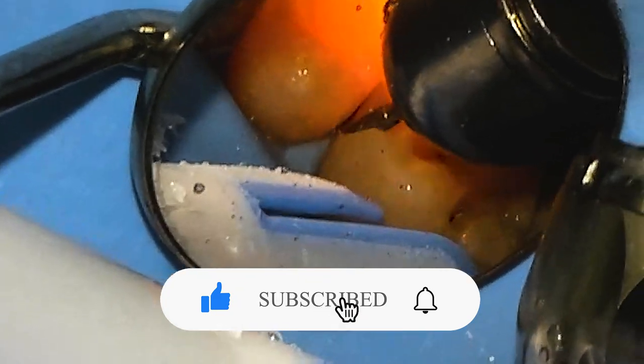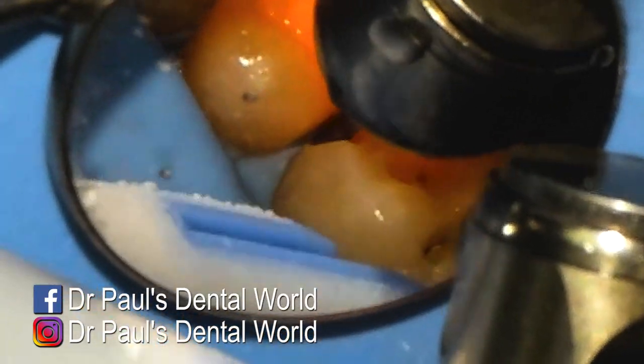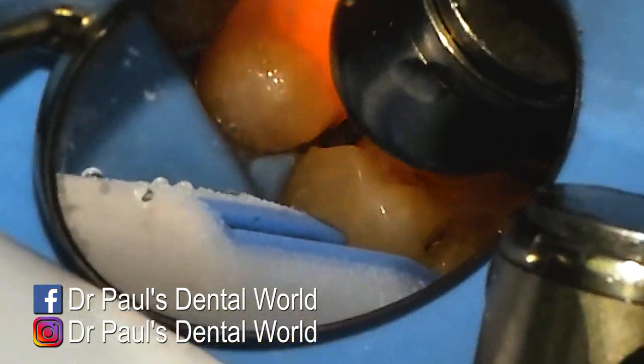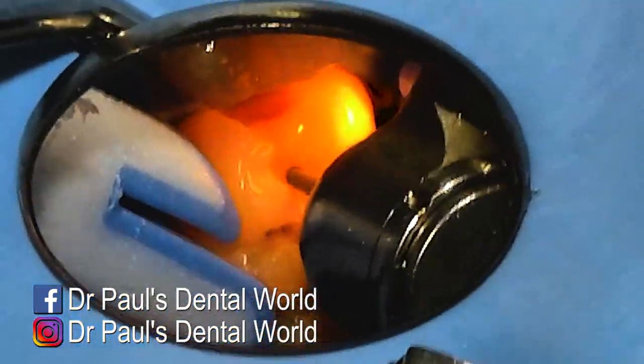Once I feel comfortable with how much I've removed, I'll feel it and visually look at it to see if I need to remove any more. When I feel with my explorer I can just feel a slight little bump, so I'll remove a tiny bit more. Then the last little bit is just back to my ultrasonic to remove any unsupported enamel.